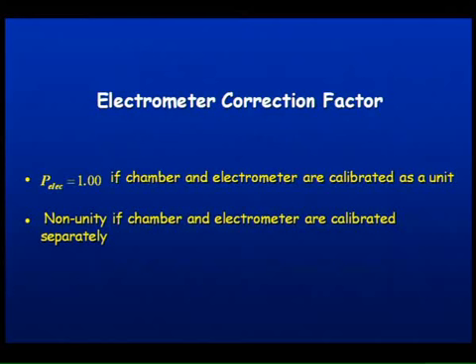Electrometer correction factor: when you send your chamber and electrometer to an ADCL, they provide you calibration factors for the chamber and electrometer. They can provide it separately.